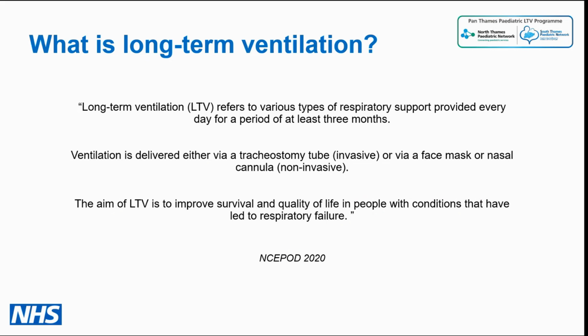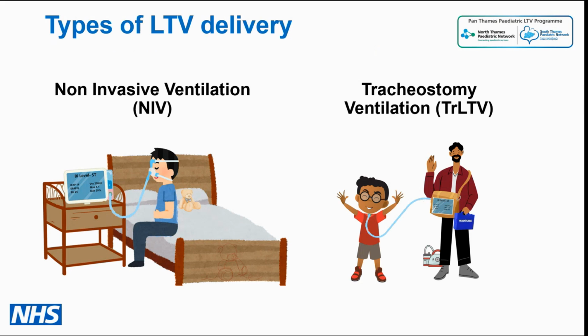The aim of LTV is to improve survival and quality of life in people with conditions that have led to respiratory failure. So, as I just said, we can deliver LTV in 2 different ways. We can deliver it non-invasively. Predominantly, we try and do a nasal mask where possible, but we do have children who are on full face or total face masks as well, or we can deliver it via a tracheostomy.